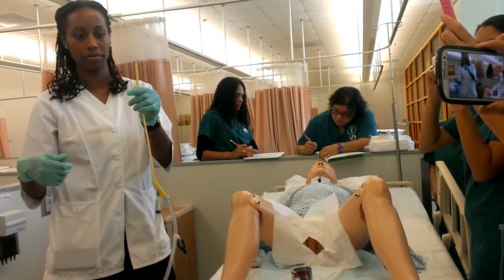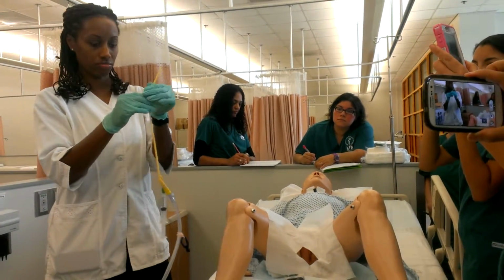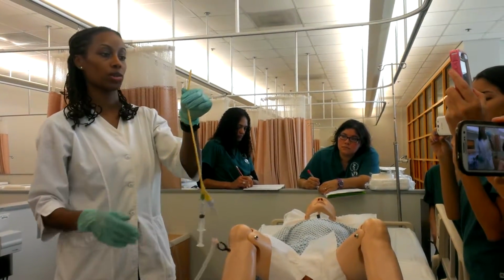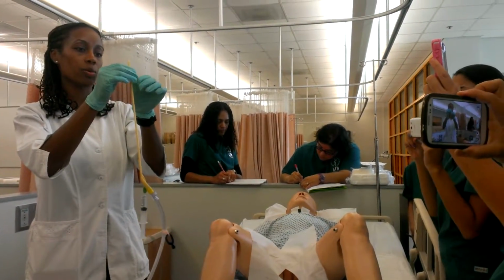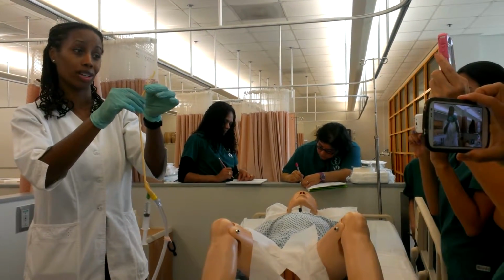Oh, okay. And that big tube's going into the little opening? Yeah, and this is a 14 French, so it's small. Standard is 16. On men that have an enlarged prostate, when they have the prostate surgery, they use like 24 French, so that's really big.